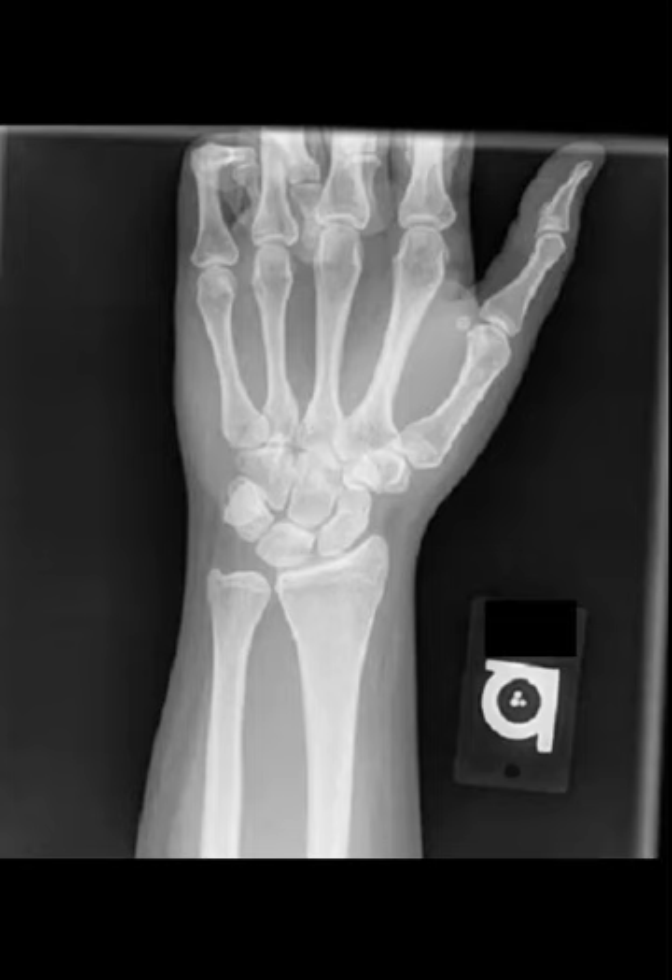These markers can help indicate whether or not the film was taken weight bearing, which is more important in the spine than in the extremities. So let's get back to the normal structures and talk about some of the things we can see within the wrist.